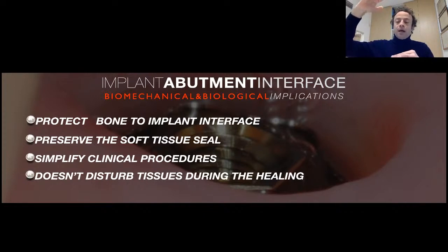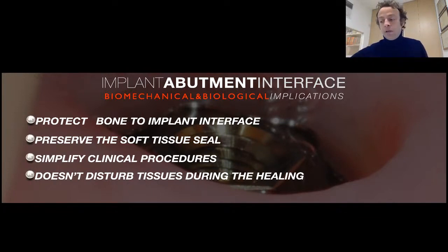And in this situation, I place a multi-unit abutment with a height of 2.5 millimeters. In the fully edentulous patient, 2.5 millimeters is for me an ideal option, because it allows me to work really at the soft tissue level, keeping the margin just 0.5 millimeter subgingivally, or sometimes where we don't have enough soft tissue thickness, we can use the 1.5, or we can use other dimensions.